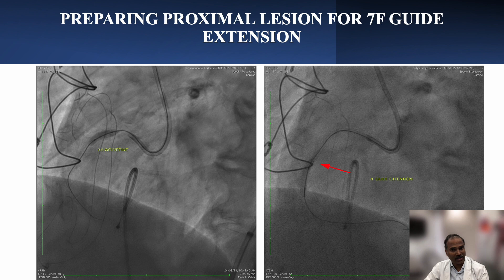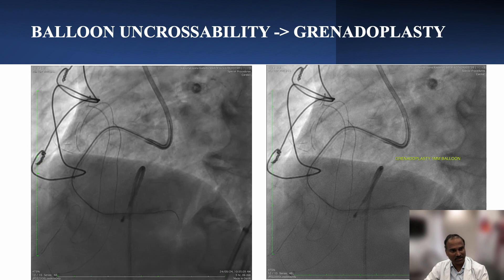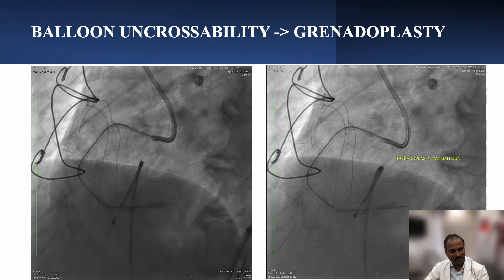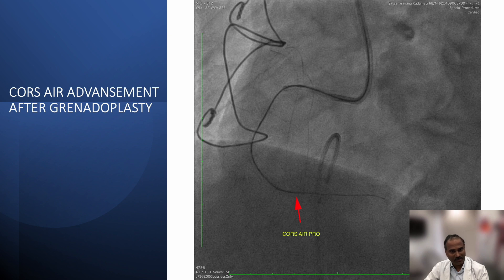We also prepared the proximal lesion further with a 3.5 mm balloon to make room for the guide extension, so we could advance balloons across the tough lesion and distal lesion. Despite guide extension and Amplatz guide, we were not able to push the Corsair catheter across the distal lesion, so we tried grenoplasty. You can see this 1 mm balloon ruptured at 20 to 24 atmospheres with contrast extravasation into the tissues. Post-grenoplasty, we could advance Corsair just beyond the lesion.